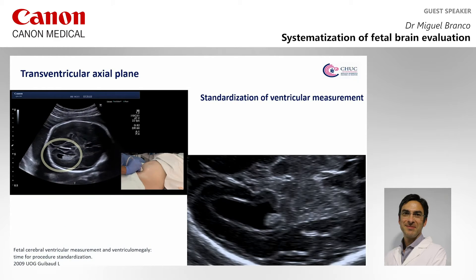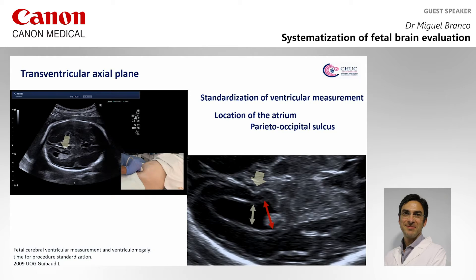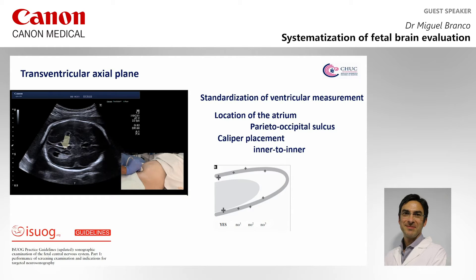In the transventricular plane, we measure the atrium. We identify the parieto-occipital sulcus and place the calipers at this level, inner to inner.